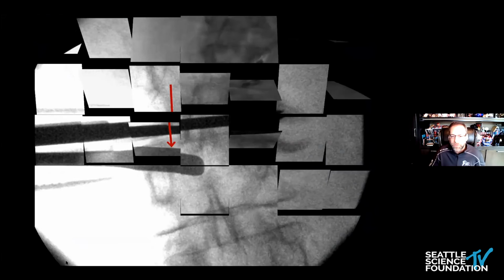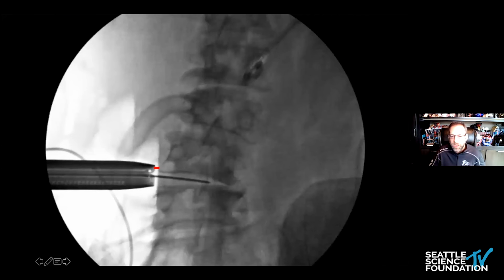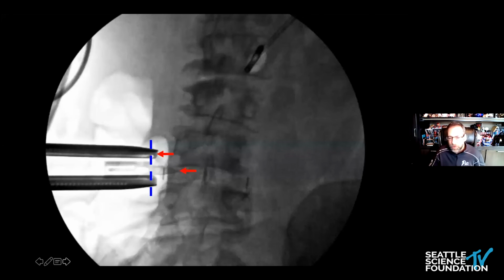So be very careful and cognizant, and use every single image as an opportunity for information. When you're performing up against the lateral spine and you're putting in grafts, there's a tendency, especially as you put your graft or your trials in, for the retractor to move away. And remember, when you're performing the Transpsoas approach, that retractor is keeping the nerves, the muscles, the retroperitoneal contents, peritoneal contents, all of which are close by. So as that retractor backs up, you can get into danger.